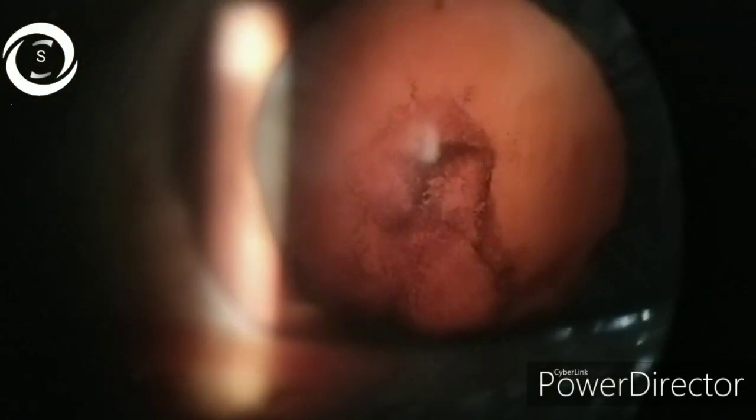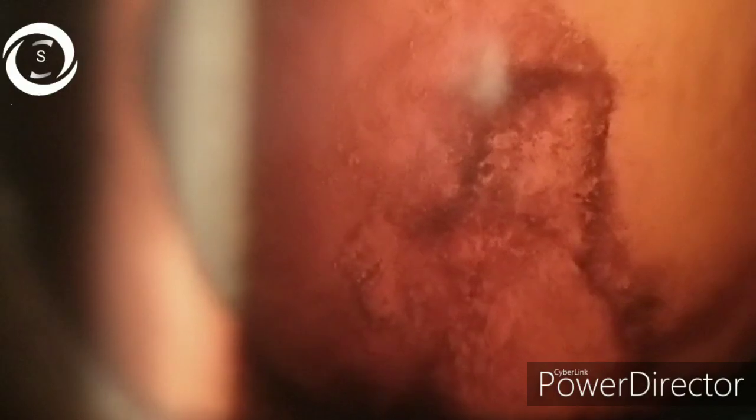Retro illumination is also done to locate and check the patency of peripheral iridotomy in angle closure glaucoma and ACIOL cases. Corneal vascularization and ghost vessel tracks in the cornea can also be highlighted.